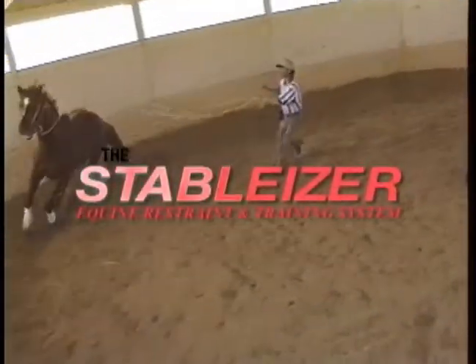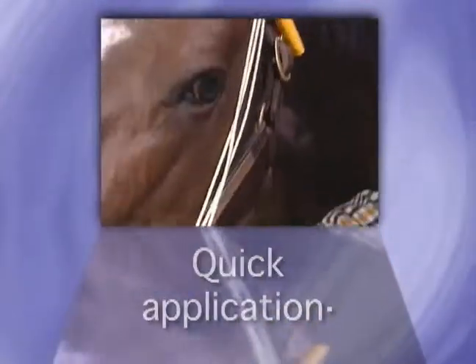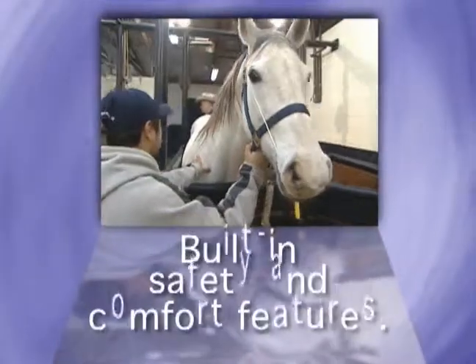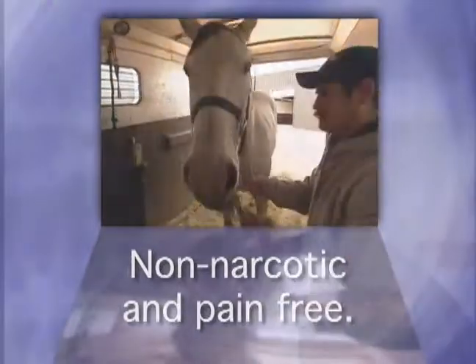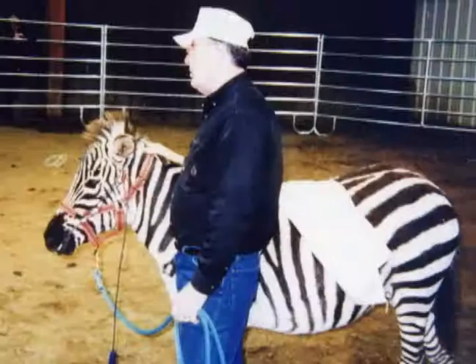Designed for ultimate ease of use and effectiveness, the Stabilizer features one-person operation, quick application, fast, easy adjustment, built-in safety and comfort features, and it is non-narcotic and pain-free. With five different sizes, there's a Stabilizer to fit every size and breed of horse, mule, donkey, even many exotics.